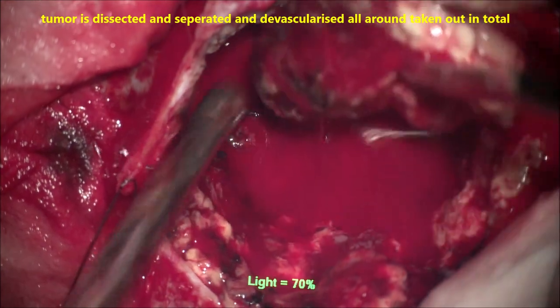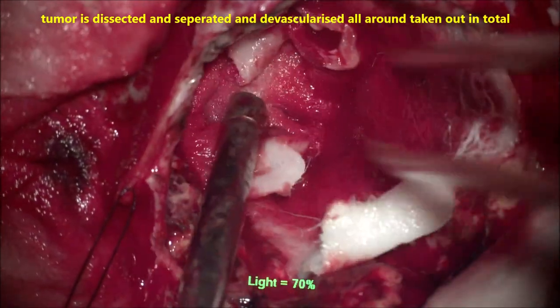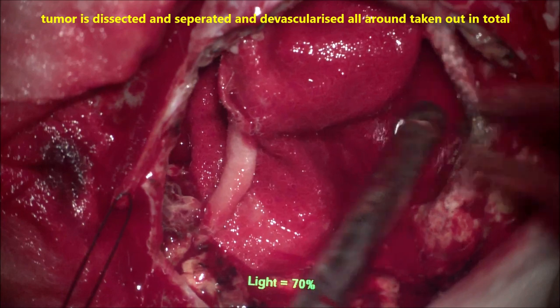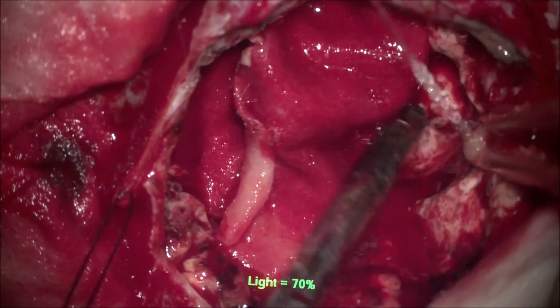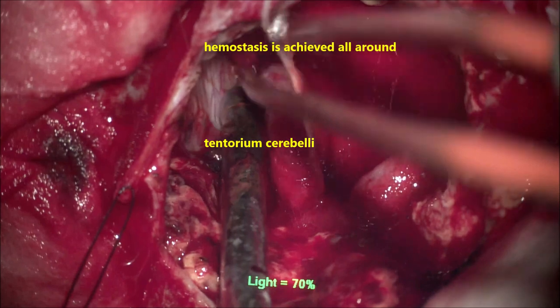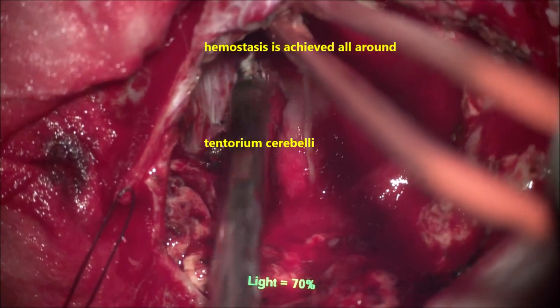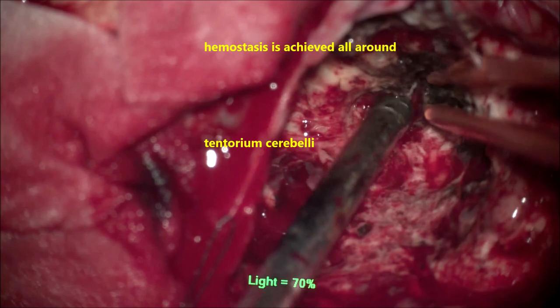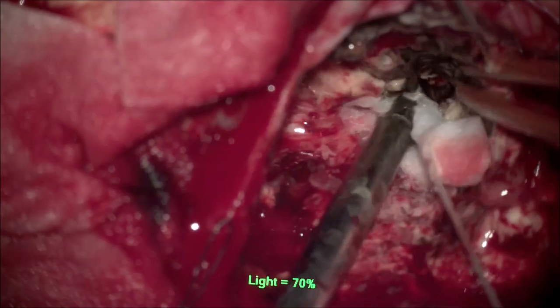The whole tumour is now separated all around — isolated and completely removed. You can see after coagulating all around, the tumour has reduced in size very significantly. The most important step now is to achieve absolute hemostasis all around very patiently. Using the nonstick bipolar, go sector by sector, layer by layer, and coagulate the small feeders from the surface and deeper areas. There is still a lot of bleeding oozing from the tentorium cerebelli. One needs to coagulate gently to achieve hemostasis, which may take about half an hour to one hour — but it is worth struggling to achieve it.